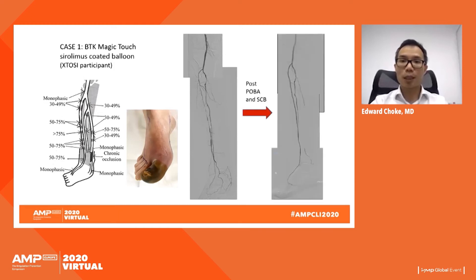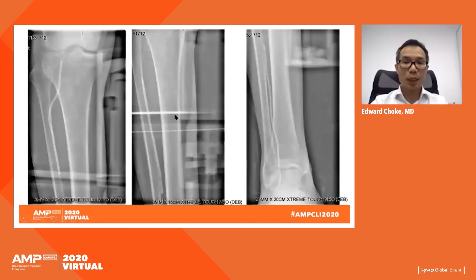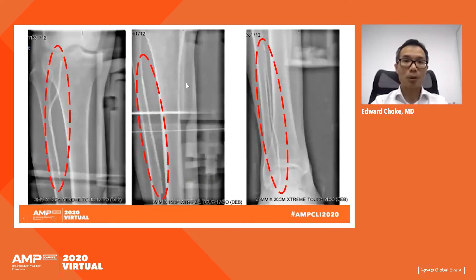After successful plain old balloon angioplasty, I applied the sirolimus-coated balloon to the entire length of the anterior tibial artery. Sirolimus-coated balloon was applied to the proximal, mid, and distal anterior tibial artery, encroaching slightly into the dorsalis pedis.